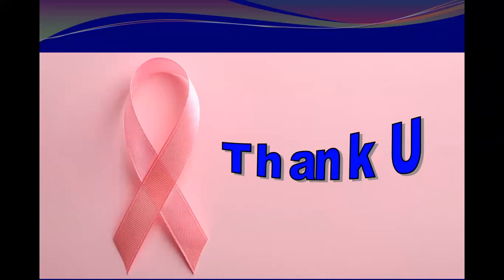How can we eliminate artifacts, even including posterior enhancement and posterior shadowing? By compounding. Excellent, well done.